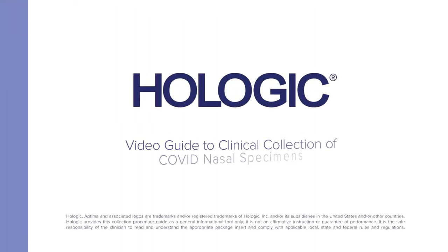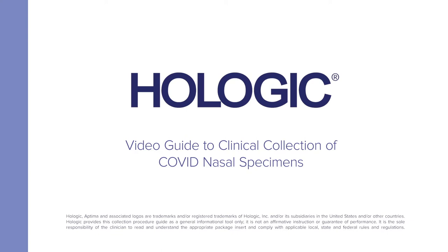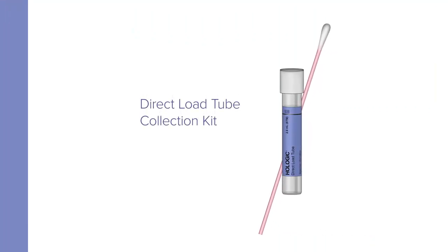Hologic presents a video guide to the collection of COVID nasal specimens by clinicians using the direct load tube collection kit.